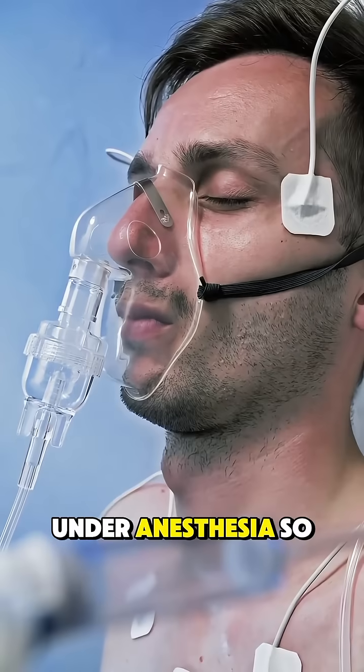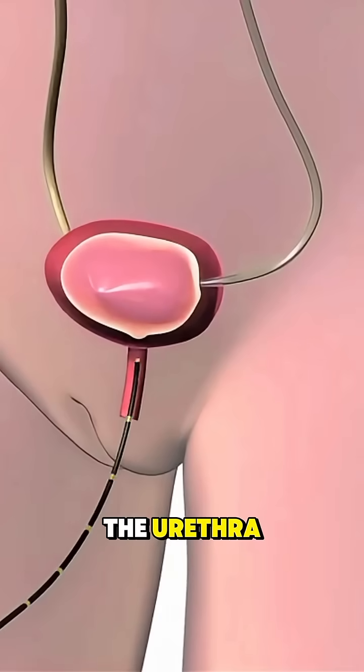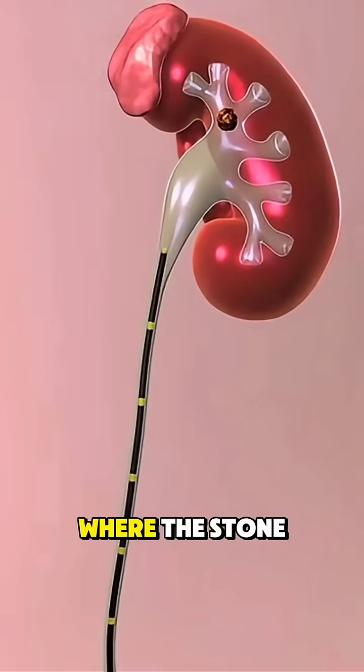The procedure begins under anesthesia, so the patient feels no pain. The scope is gently inserted through the urethra, guided into the bladder, and advanced upward into the ureter where the stone is located.